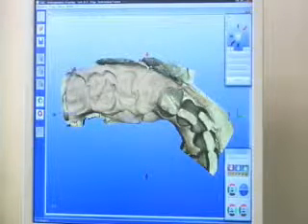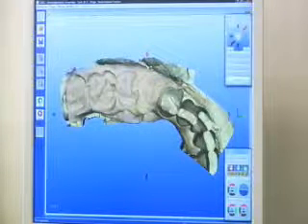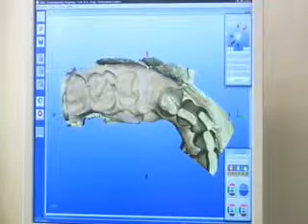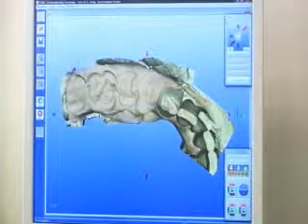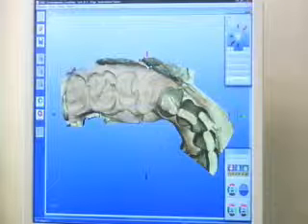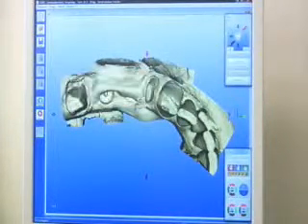The overlay is used so we will be able to set the proportions of the first proposal and carry that forward. After you do your imaging and you take your bite, you will trim your antagonist, much like you do when doing single units. We go around, we trim any of the extra stuff out.